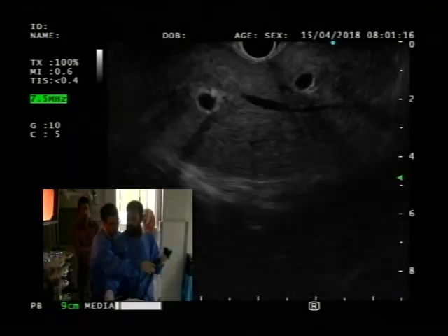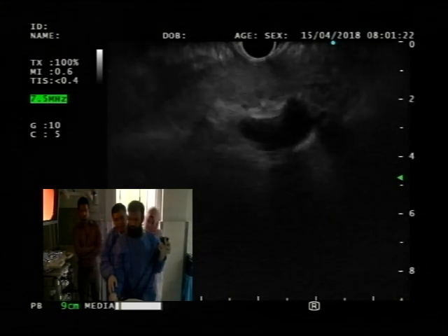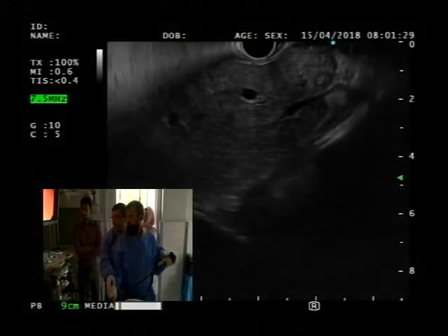Just let it relax, and take a look at this number. Like right now, nothing is happening. So straight, you see that? That starts moving now. So here, come back a little bit with the scope, big wheel towards you, please.